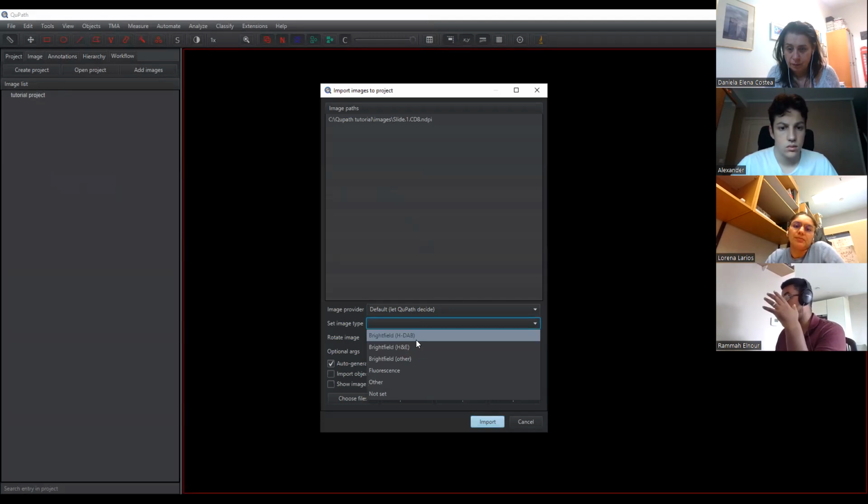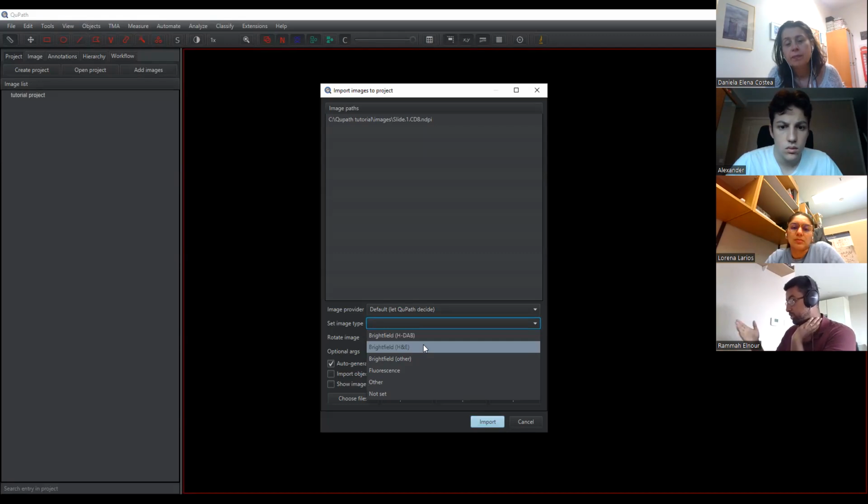For example, if you have a hematoxylin image, you would select that. The images we'll be working with today are immunohistochemistry for CD8, for cytotoxic T cells, in a vulvar cancer cohort. So it's an IHC image, and therefore I would select H-DAB: hematoxylin to stain nuclei, and DAB to visualize the expression of the CD8 surface marker within the cells. This is the correct option for this particular image. But if you're working with H&E images, as I mentioned, then you'd select that instead. Here I'll select this.